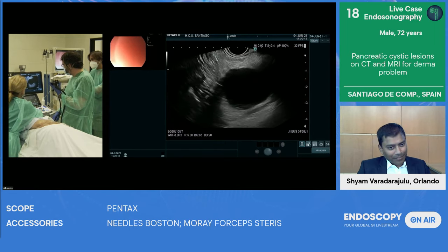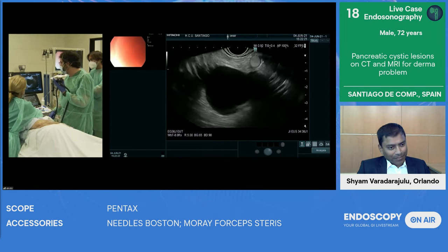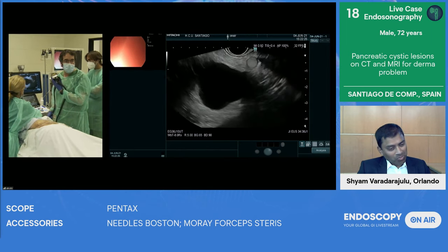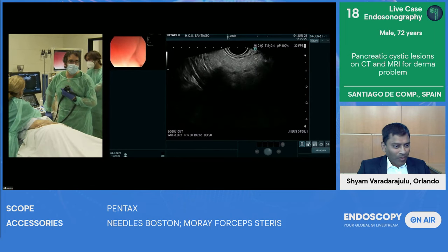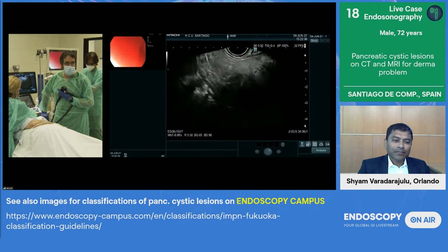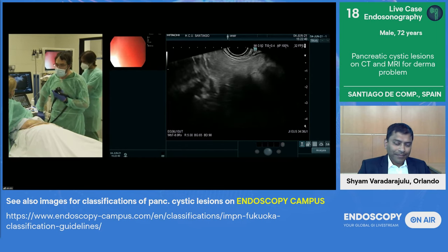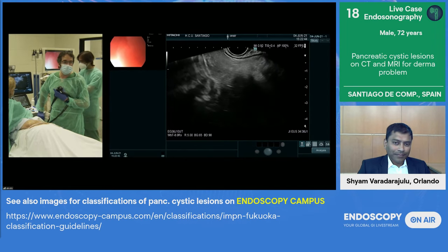So I think the access of the scope is not so bad. And we will try. And if we're able to place the moray, we will try to use the moray to exclude if there is any kind of a strange finding. We are also trying to work together with the pathologist in order to optimize the differentiation between the subtypes of IPMN, which is my suspected case in this patient, because we know the malignant potential in the different subtypes is completely different.